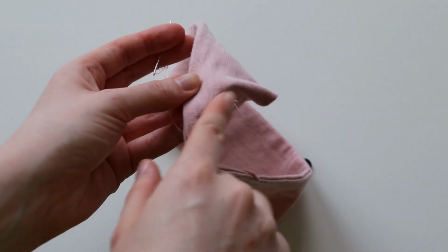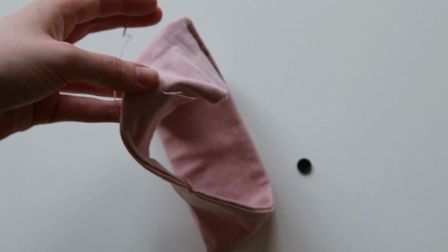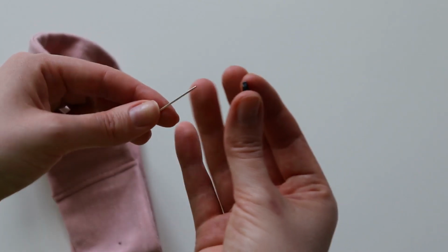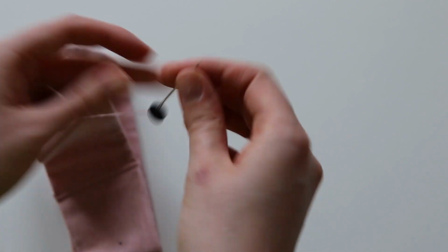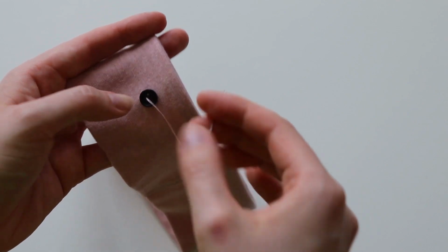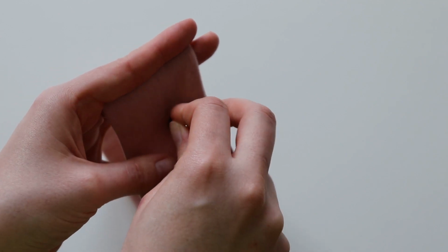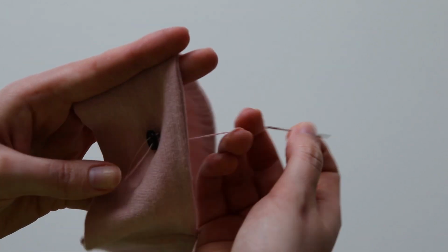And you can see, because we made that big knot back here, this is now sticking on this side. If you would like to, at this time, you can feel free to trim off any extra little pieces of thread that you might have. But before you do anything else, you now just want to go ahead and attach your buttons. So sticking your needle through one of the holes, you are just going to add that on there, covering up your mark, and now going across, you are going to go through one of the other holes to secure this down. Again, making sure you are not piercing through both sides of the headband.